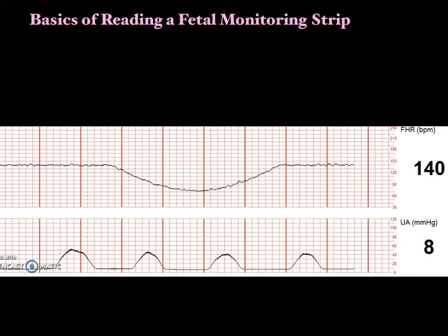Somebody who was a Suboxone user. She had been on heroin and she was using Suboxone as maintenance, and her baby had a heart rate that was about 100 beats per minute, and that was just the baby's baseline. It made us all very nervous. And that was sort of one of those cases where you put a pulse ox on mom and showed her, it showed on the strip that you had two heart rates because mom's heart rate was very similar. So that's fetal bradycardia.